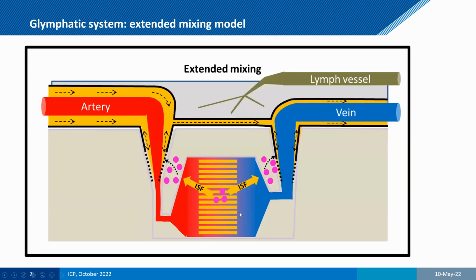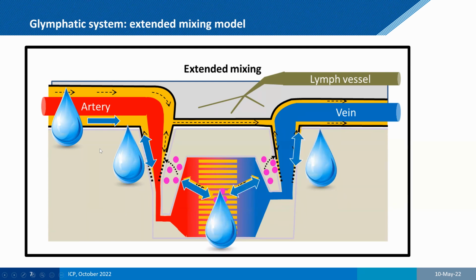So if we then look back at this schematic, one thing that you might notice is that quite a bit of this schematic involves water or water-like fluids, like the CSF flowing into the perivascular spaces, then the ISF, and then the outflow either along the veins or along the arteries. And this is of course very good news for MR, because MR is mainly based on imaging the protons in water. So this puts MRI really at the forefront of creating non-invasive techniques.